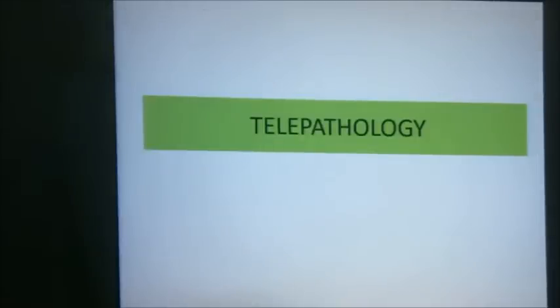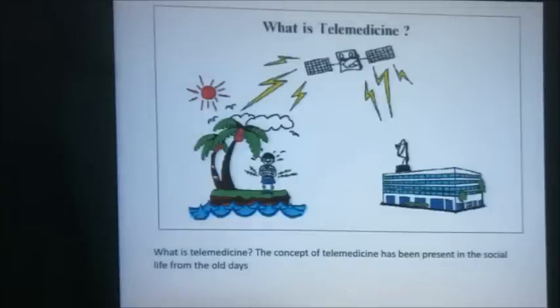Now we'll move to another use of IT or information technology, which is telepathology. Telepathology or telemedicine in general means that you are here in an island, okay? And this is the hospital, and they send you a signal, please, we need you, okay? You have your mobile phone or you have your laptop, and you can actually help them in diagnosis while you are away, okay? This is the idea, the funny idea of telemedicine or telepathology, okay?